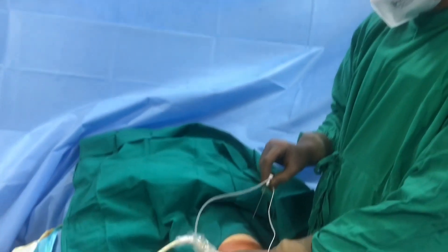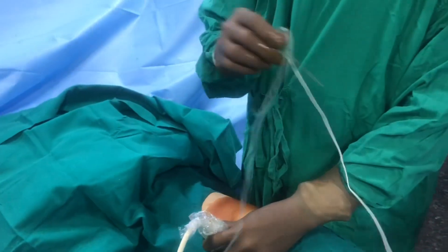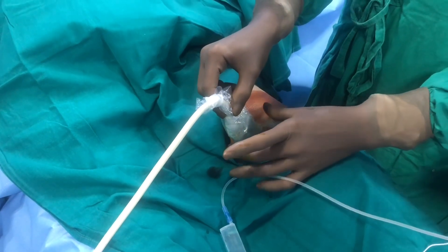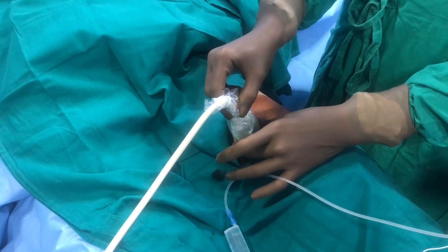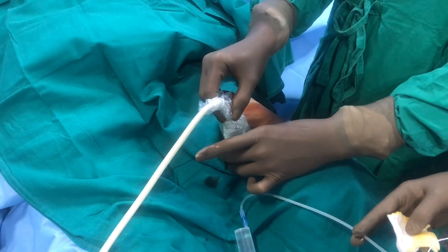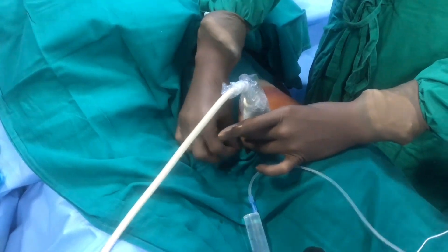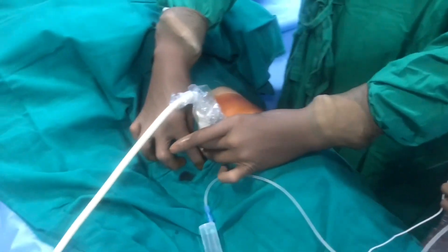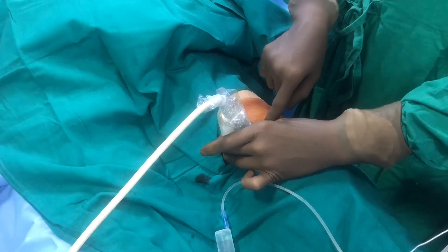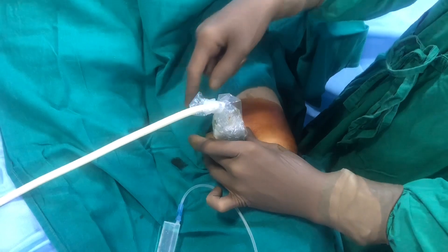Can you focus on how I am holding the probe? I am holding my probe way down here and keeping my ring finger right at this point — is it seen nicely? So this finger position and the entry point of the needle are my two reference points.